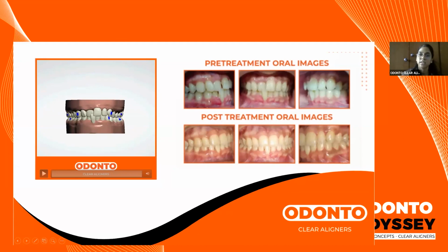Up to 15 to 20 sets will be required for a single tooth crossbite to be corrected, wherein you have to ensure that you don't have a lot of other malocclusions along with this single tooth crossbite. It can't be that at the posterior you have a lot of rotations, or at the anteriors you have severe crowding, plus you have a crossbite. Then in that case, your category immediately changes from something which is mild. It moves on to your moderate to severe category, depending on what is present for that patient.